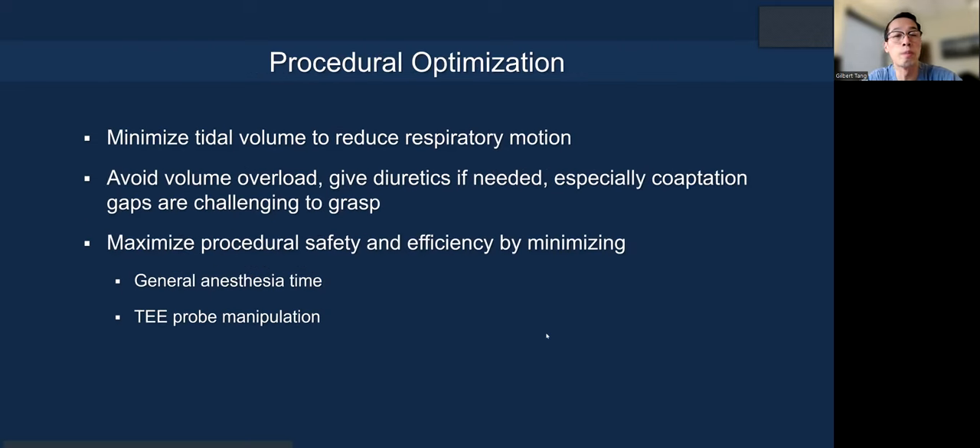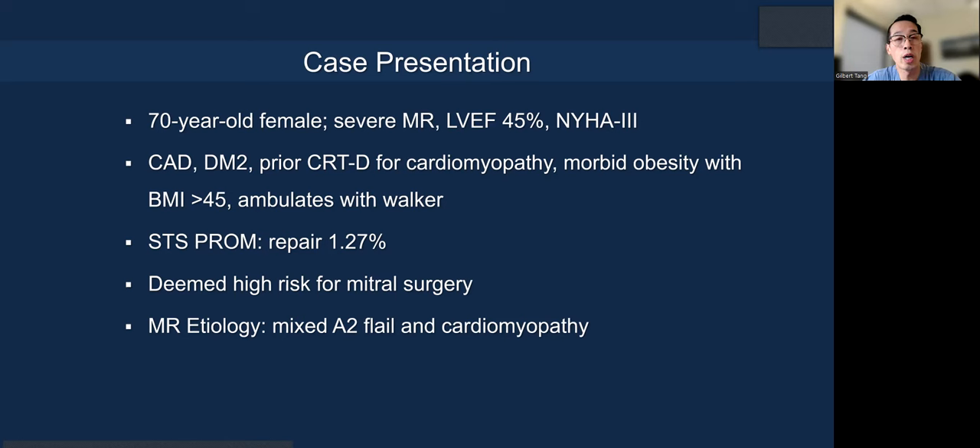How do you optimize the procedure from the get-go? When the patient is in the room after intubation, minimize the tidal volume to reduce respiratory motion, especially in patients with a hyperdynamic LV — you don't want the clip to keep shifting with your target. Make sure the patient is somewhat euvolemic; you might need to give diuretics, especially in secondary MR, to reduce the coaptation gap. You can maximize procedural safety and efficiency by minimizing general anesthesia time and TEE probe manipulation, because those are not benign, especially in elderly or frail patients.